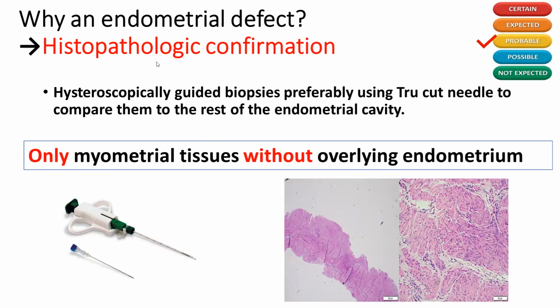You mentioned that it is an endometrial defect. Why is it a defect? I showed you that the epithelium is not covering it during the examination of patients with endometritis. How to prove it? Probably it is not covered by epithelium. The proof was by taking a true cut sample from some patients, and we introduced the true cut alongside the telescope to take the biopsy from the fundus.